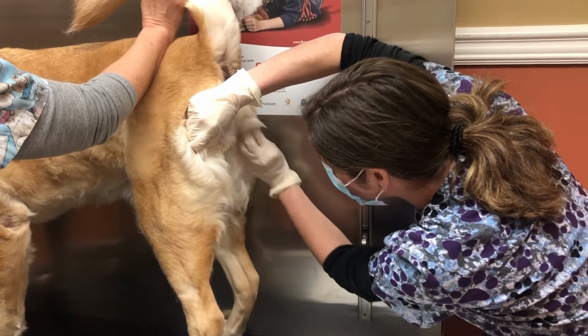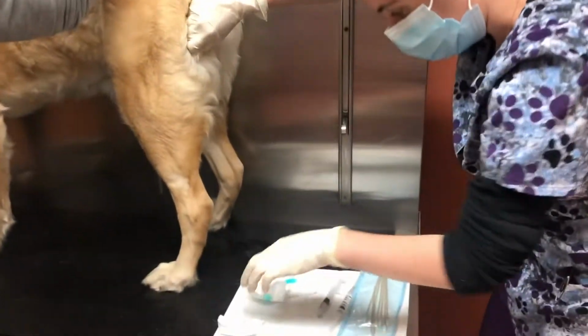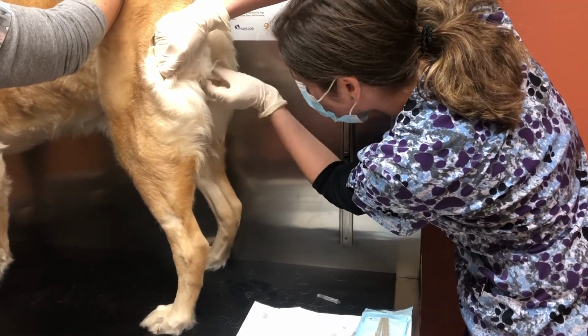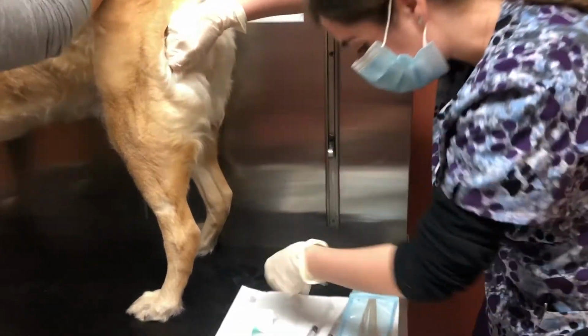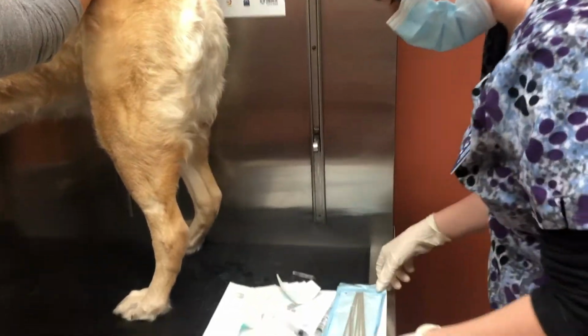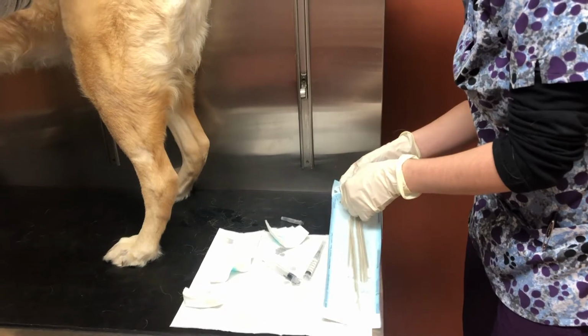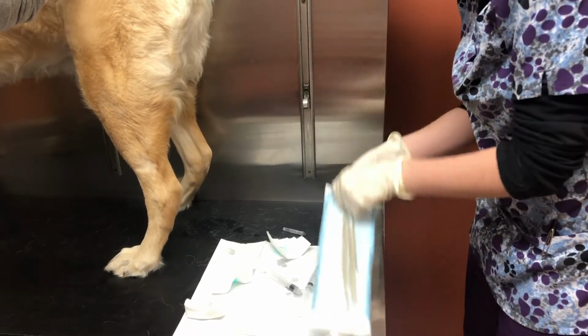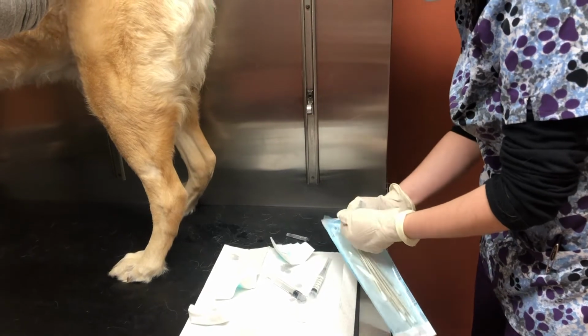Just going to clean it around there. Alright, next thing I'm going to do is open my sterile applicator swabs, and I'm going to moisten the tips of them with more saline.